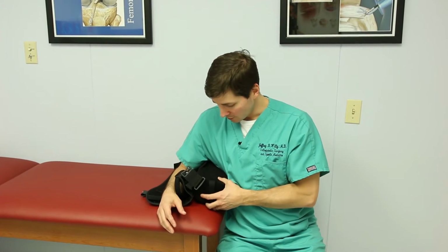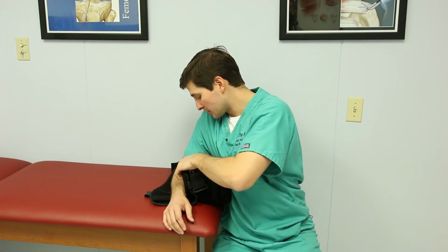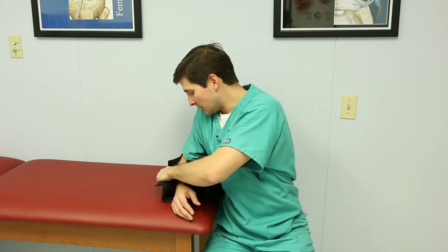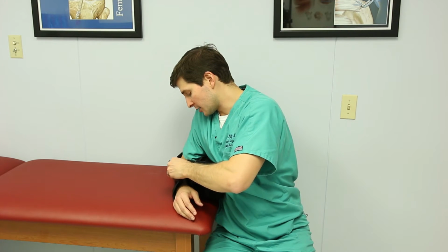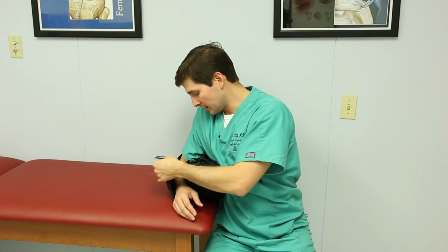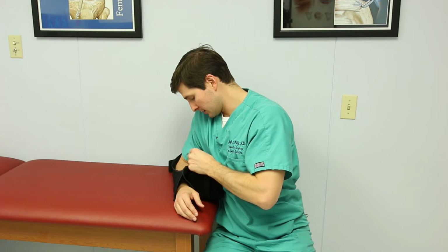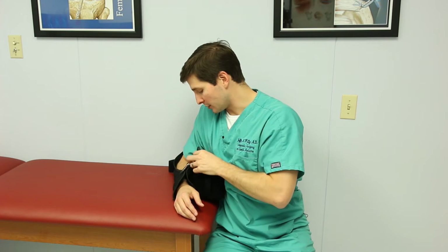I can adjust the pillow so it's nice and comfortable at the side. Then I can reach around and make some final adjustments onto the sling right here, really trying to avoid using the shoulder, with the table supporting it, so it's pretty easy. You're just going to pull on that and make that adjustment. You can get your Velcro strap, pretty much do it all one-handed like this, and get that ready to go. Just using one hand, you can flip it through like this. You can either do this right now or at the end, and that gets that arm secure in the sling.